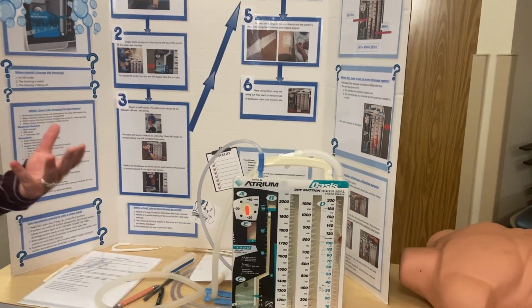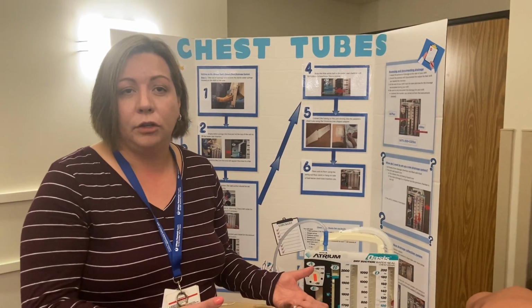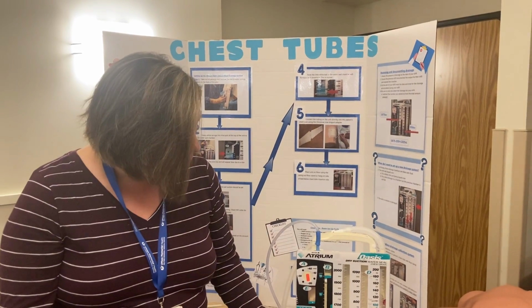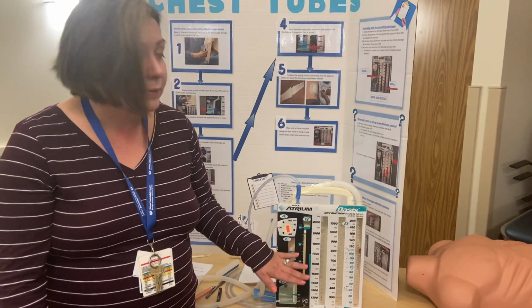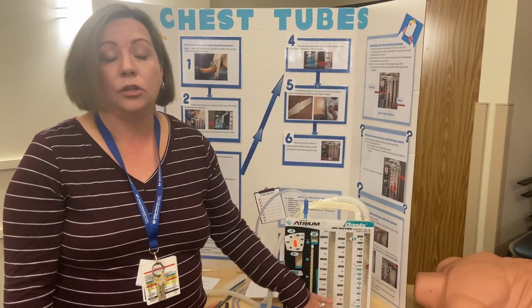And otherwise, if you kind of understand the science behind it, I think it makes it easier to take care of the tube properly. So just remember, as the nurse here, don't be too intimidated by this. Your most important section is the water seal chamber. As long as that is up to 2 centimeters, as long as everything is connected, you should be able to manage it just fine and monitor the output.